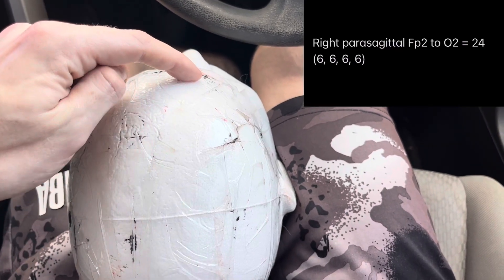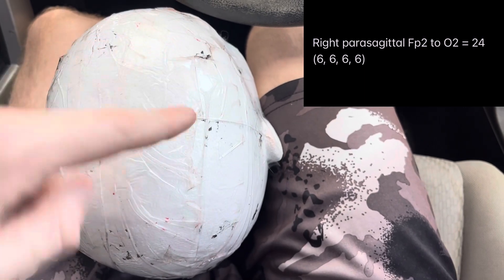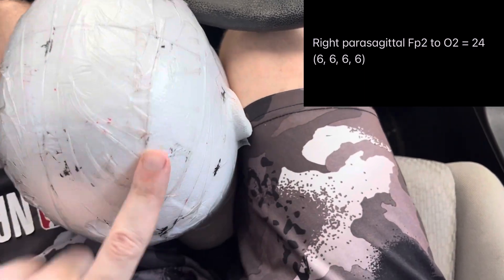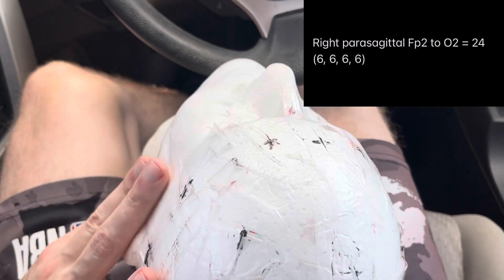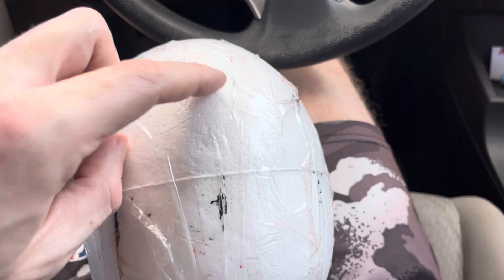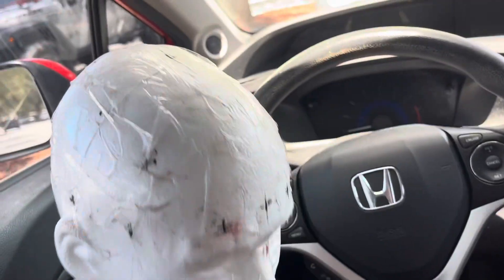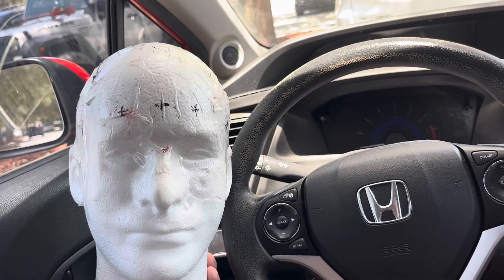We do the same thing for the right parasagittal: FP2 to F4 is 6 cm, F4 to C4 is 6 cm, C4 to P4 is 6 cm, and P4 to O2 is 6 cm. Those final parasagittal measurements are great for crossing your initial marks and making sure everything looks perfect — and then you'll have a perfectly measured head.